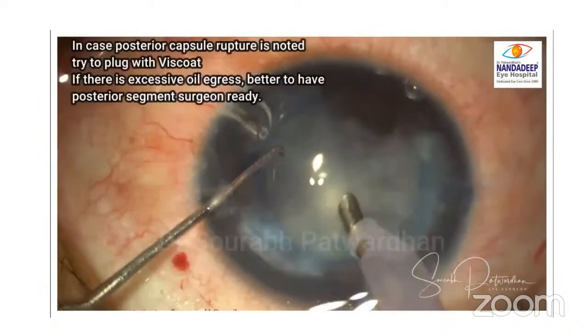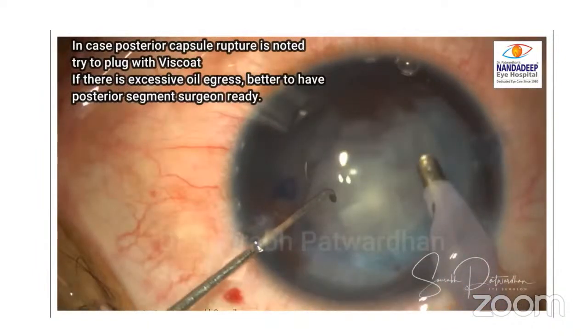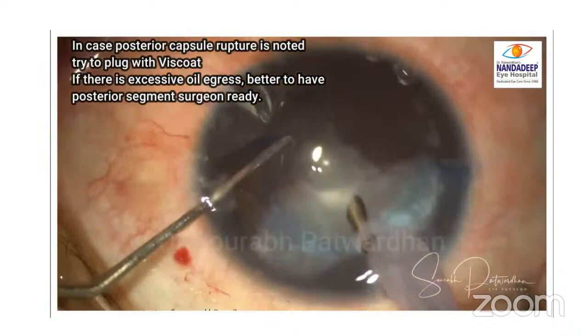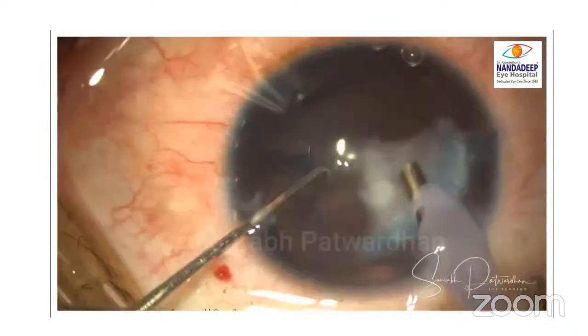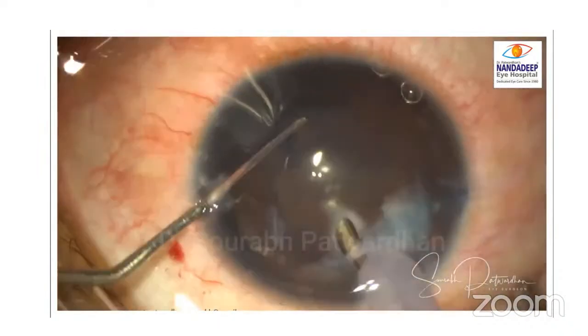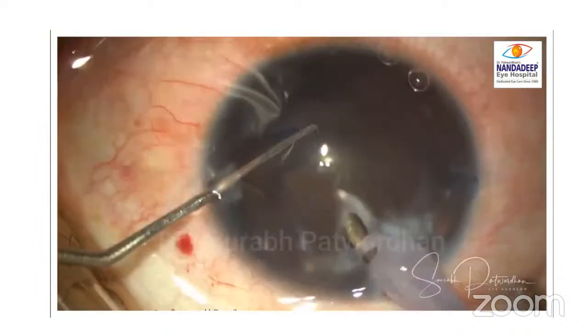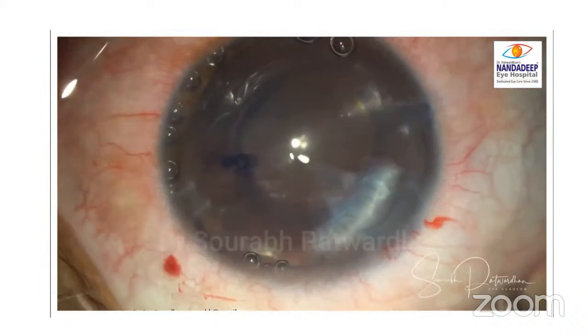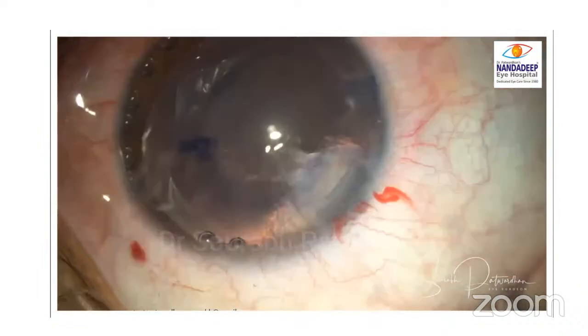I'm very carefully looking for any posterior capsular rupture here. In case it is noted and there is oil egress, we can use viscoat or hylucoat to plug that area, and then continue the phacoemulsification. But if there is an excess amount of oil coming out, the posterior segment surgeon has to be consulted.